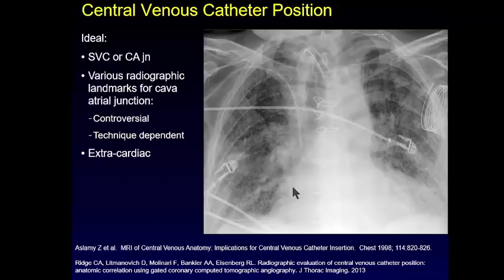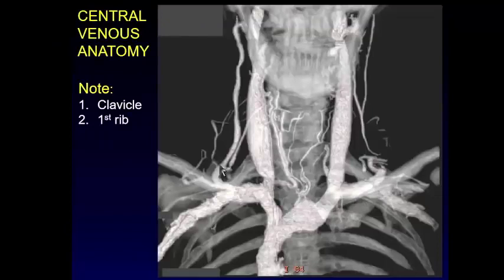There are a few rare case reports. Catheters that are in the right atrium can also lead to arrhythmias, and if it gets in the region of the tricuspid valves, you can get vegetations. In certain circumstances, catheters may intentionally be placed into the upper right atrium, for example, dialysis catheters, to try to decrease the incidence of fibrin sheath, but in general, that should be viewed with caution.